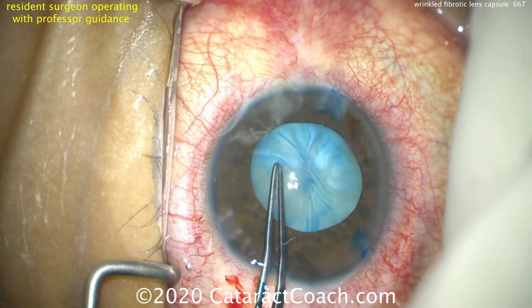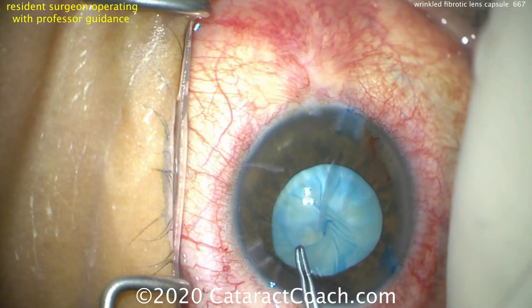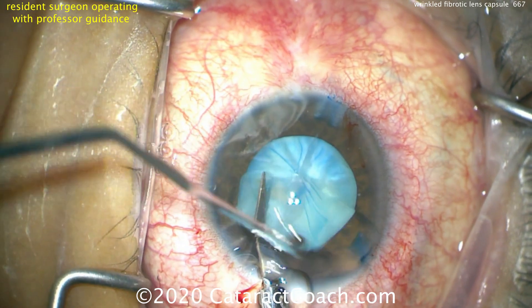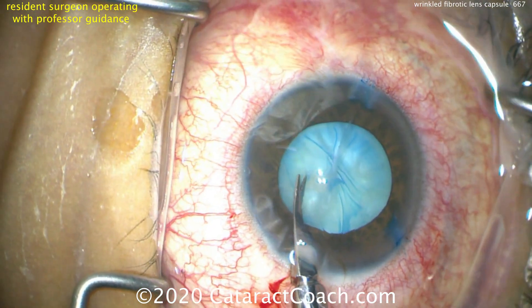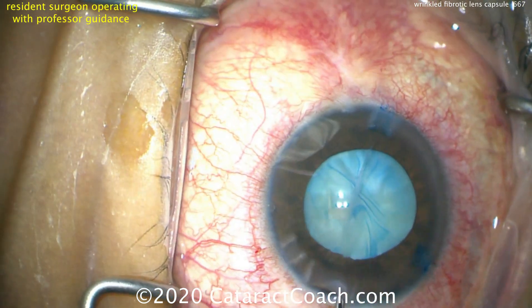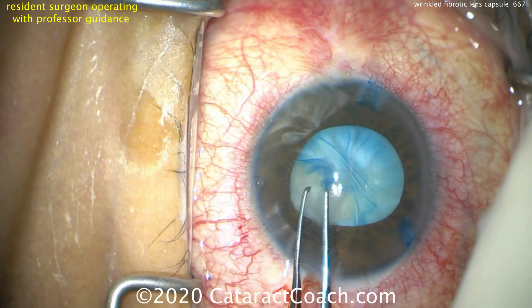Now it's safe to go ahead and make the main incision and let's try to tear the rhexis here. Grabbing the capsule and it just doesn't tear. We're going to use these small Van Ness scissors to make a cut in the anterior lens capsule, and then we'll try again to tear a capsulorhexis. We make a small cut there and we can now tear a capsulorhexis — and here we go.